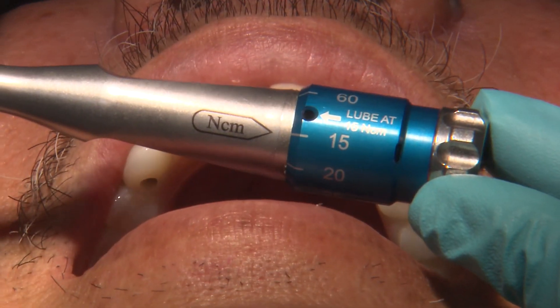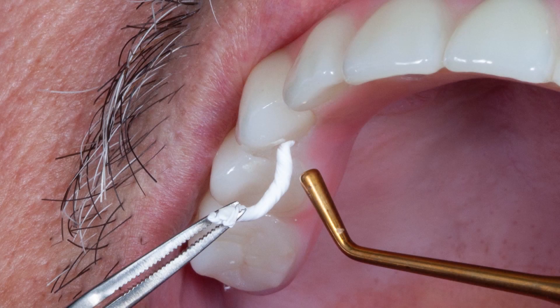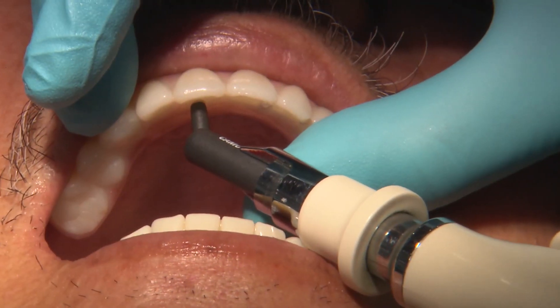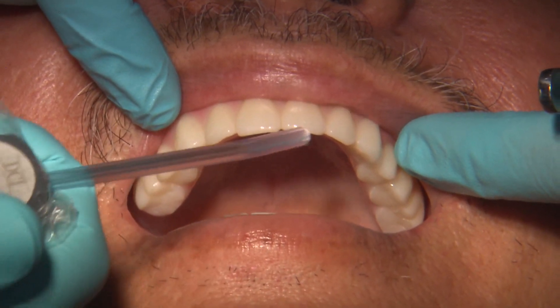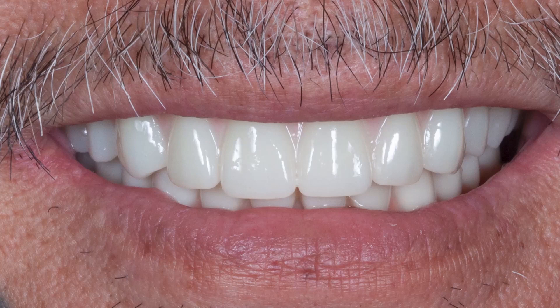These are multi-unit prosthetic screws so they're going to be torqued down to only 15 Newton-centimeters. For the Teflon tape, I roll it up into little tubes and then push it in with a composite plugger. Once they're all in the channels, I leave about 3-4 millimeters of space for composite, fill it up, and then check and adjust the occlusion.